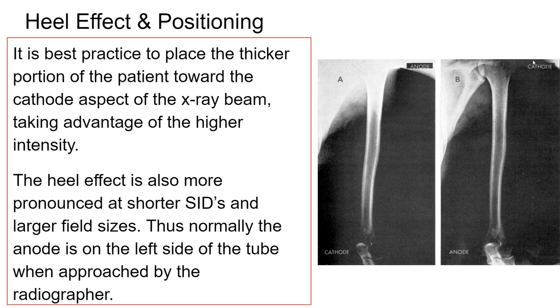When you try to do this in the lab, it pretty much gets cleaned up. In other words, they both look pretty much the same. It's hard to see this now in the digital world, because in the digital world, the computer lightens this up and darkens that up, right? And kind of fixes it. So the only way to really show this conceptually in the lab is with using the digital dosimeter, right?